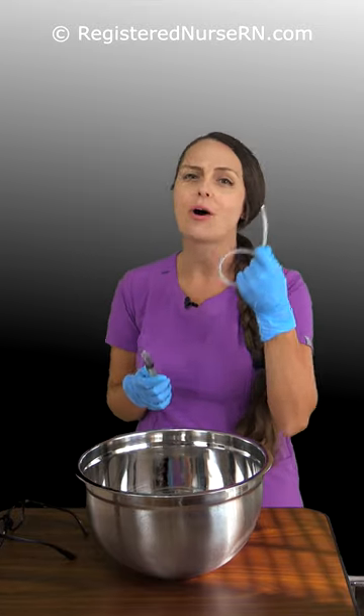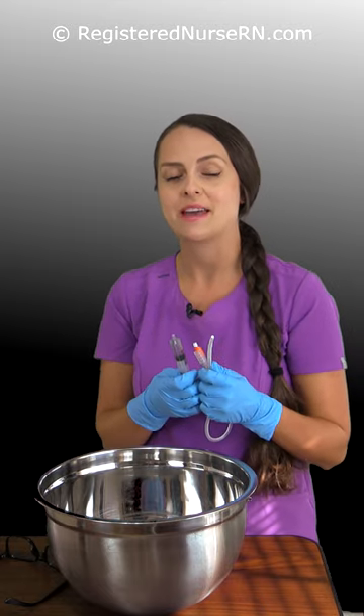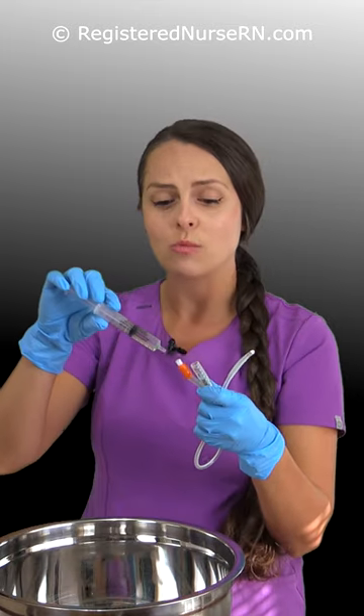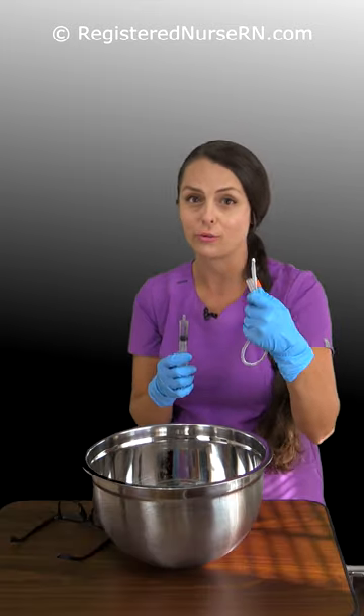How much water does it take to actually pop one of these Foley balloons? I don't know, let's see. This experiment is inspired by a comment someone left me about how a nurse was supposed to be flushing the Foley catheter, but instead was adding water into the balloon inflation port. So I want to see how much this thing can actually hold.